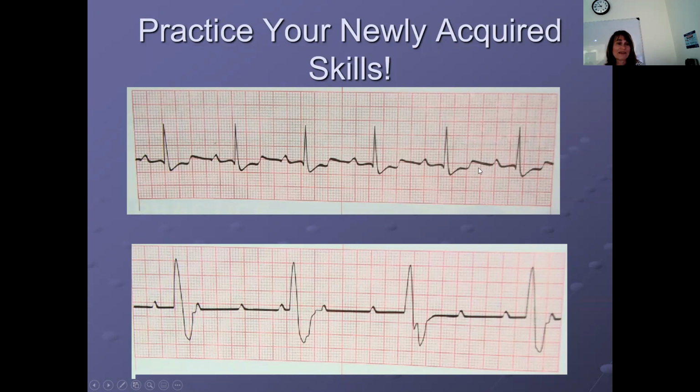That one's confusing because this looks like a P wave. Yeah. If that's a P wave, where's the T wave? The one below it looks like it doesn't seem to have, there's that one. The one below it? Yeah. The strip on the bottom? Okay, so let's look at the strip on the bottom. Tell me what you think. Because the rate's so slow, and there's a P wave without a QRS. Okay, very good.